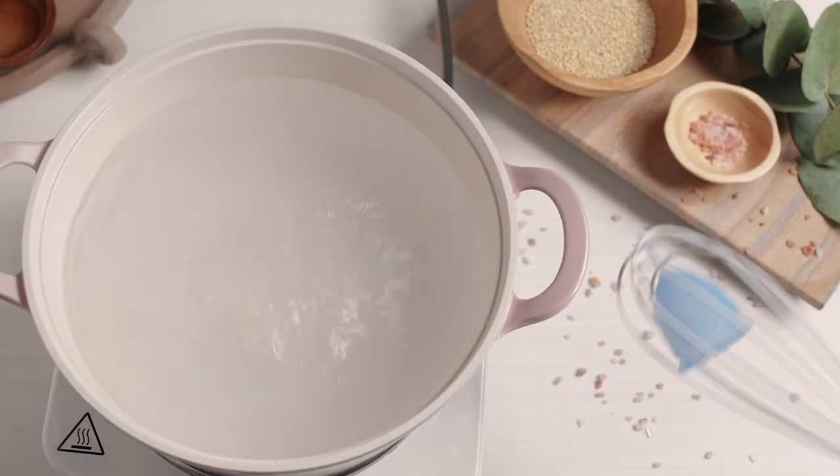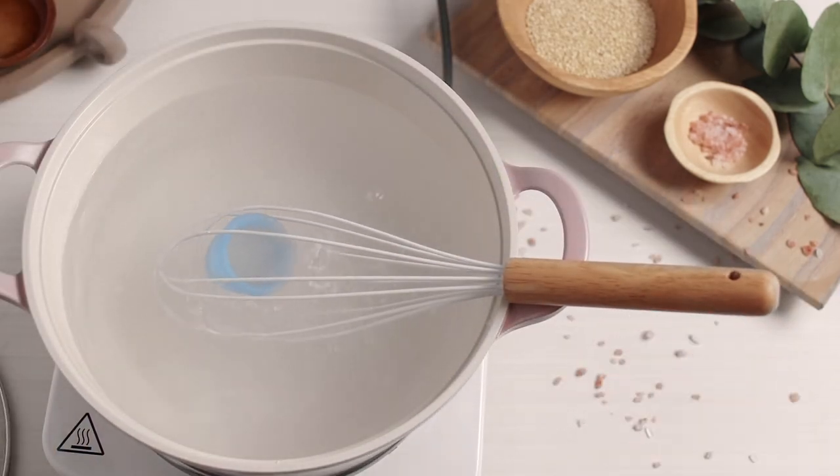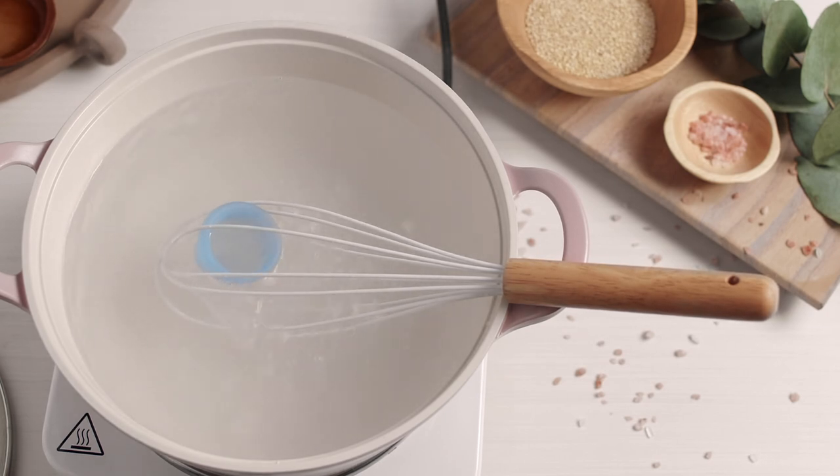To fully disinfect your cup between cycles, boil your cup in water for four to five minutes, but no more than seven. Use tongs or a wire whisk to ensure the cup doesn't touch the bottom of the pot.